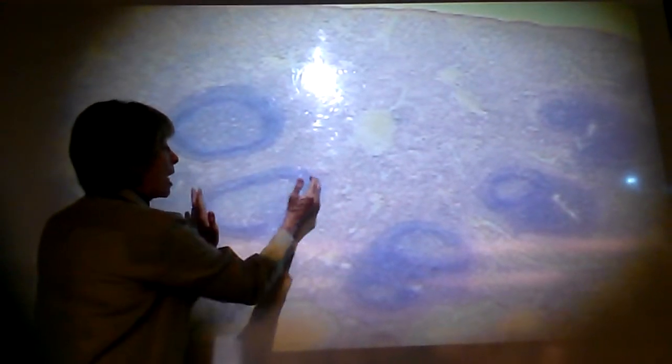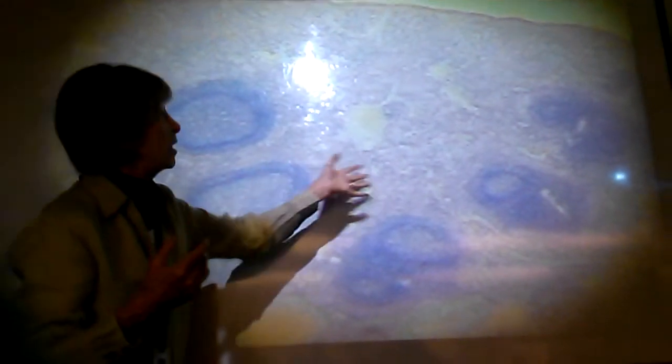So the germinal center of a lymphoid nodule, and in the spleen, this lymphoid nodule is called the white pulp. Think white blood cells. That's what you find here. So the coloring can throw you off. The rest of it is the red pulp. So the bulk of the spleen is the red pulp.